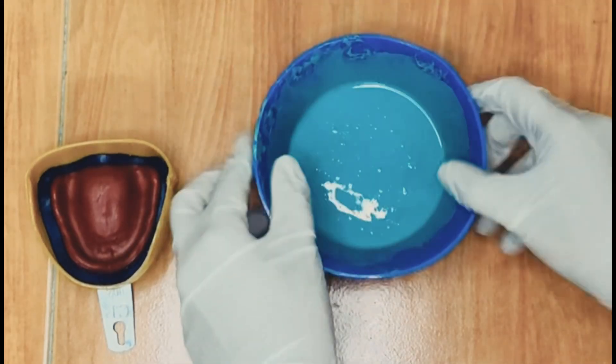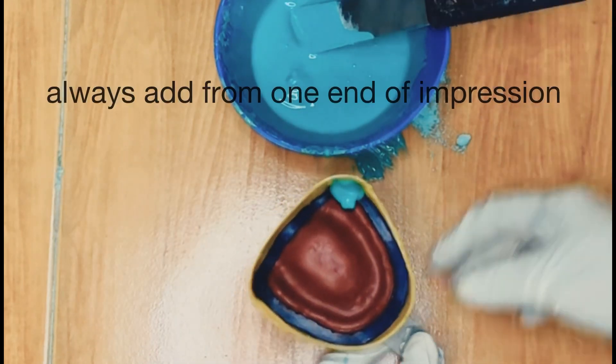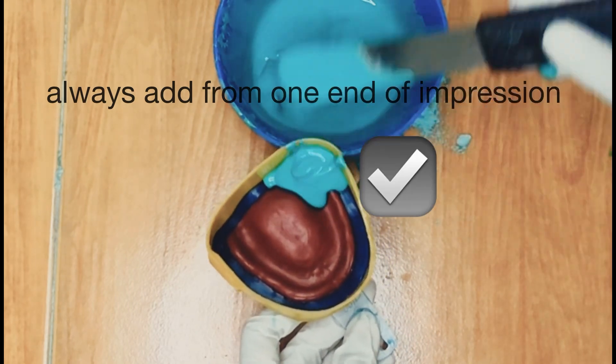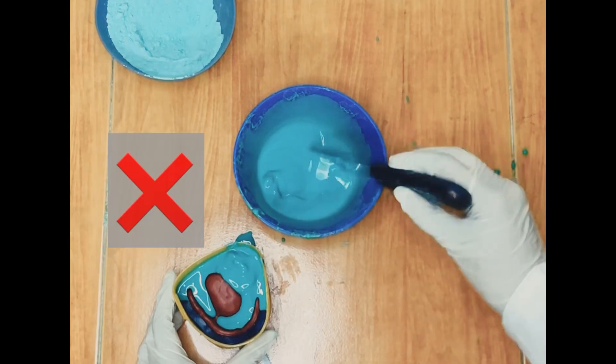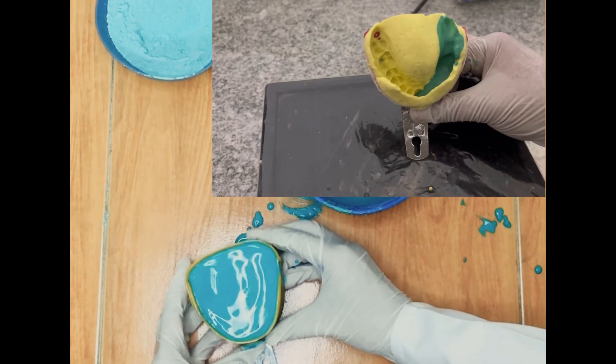Add material into the impression at the distal corner. Keep adding more material into the same point and allow the weight of the material to flow over to the other regions. Do not add material randomly all over the impression as this can result in a lot of voids.